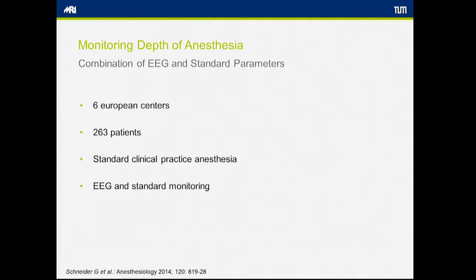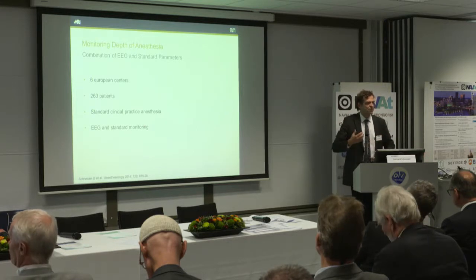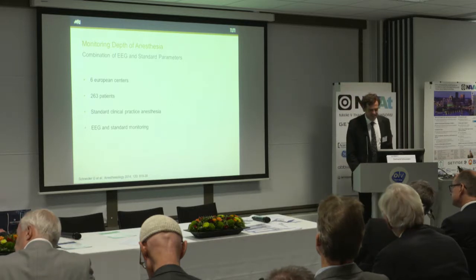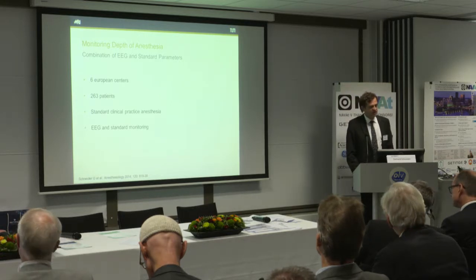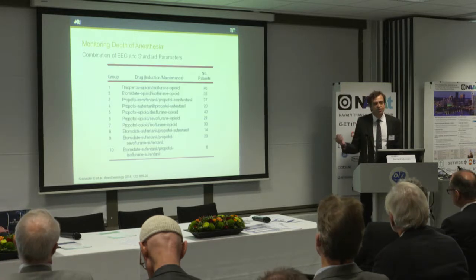And this is basically a study that we did in 6 European centers, and different to other approaches where they compared standard clinical approach to EEG-based approach, we tried to integrate this information with EEG and standard monitoring. Now this is still the probabilistic approach, but this includes more information than EEG only.